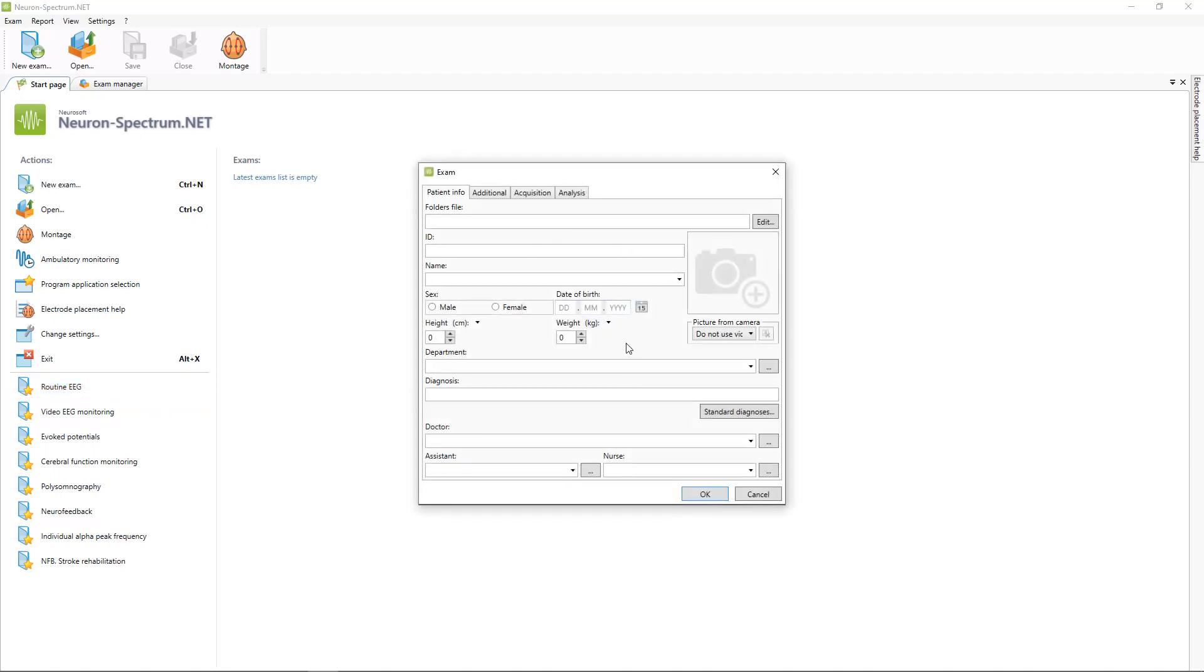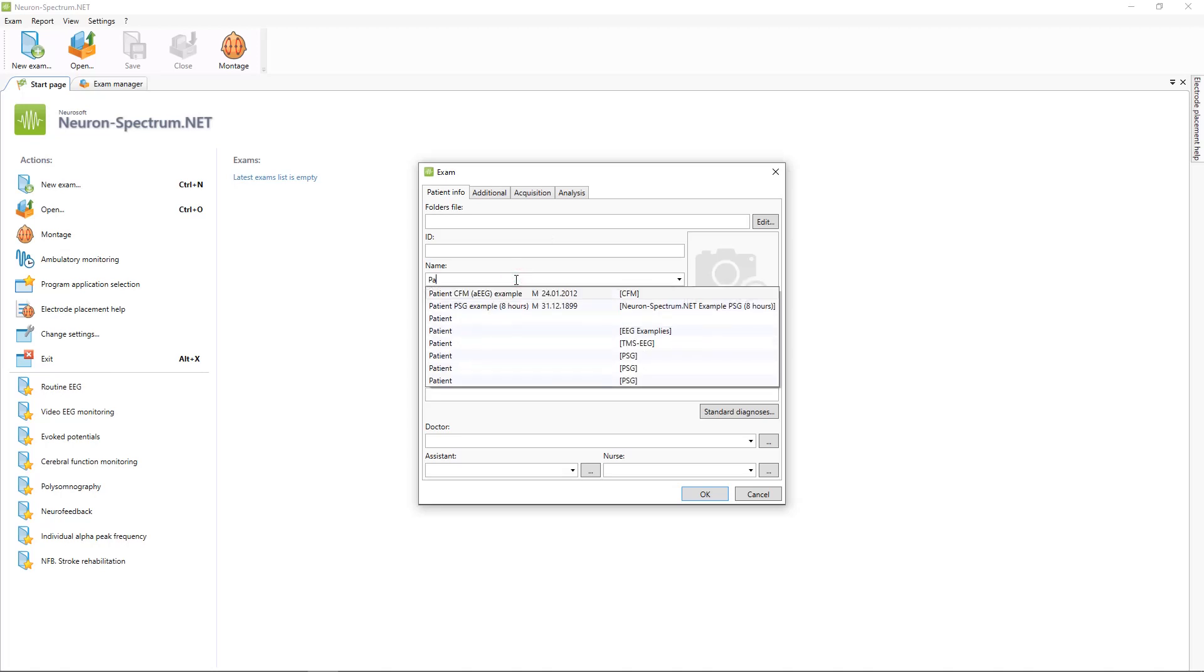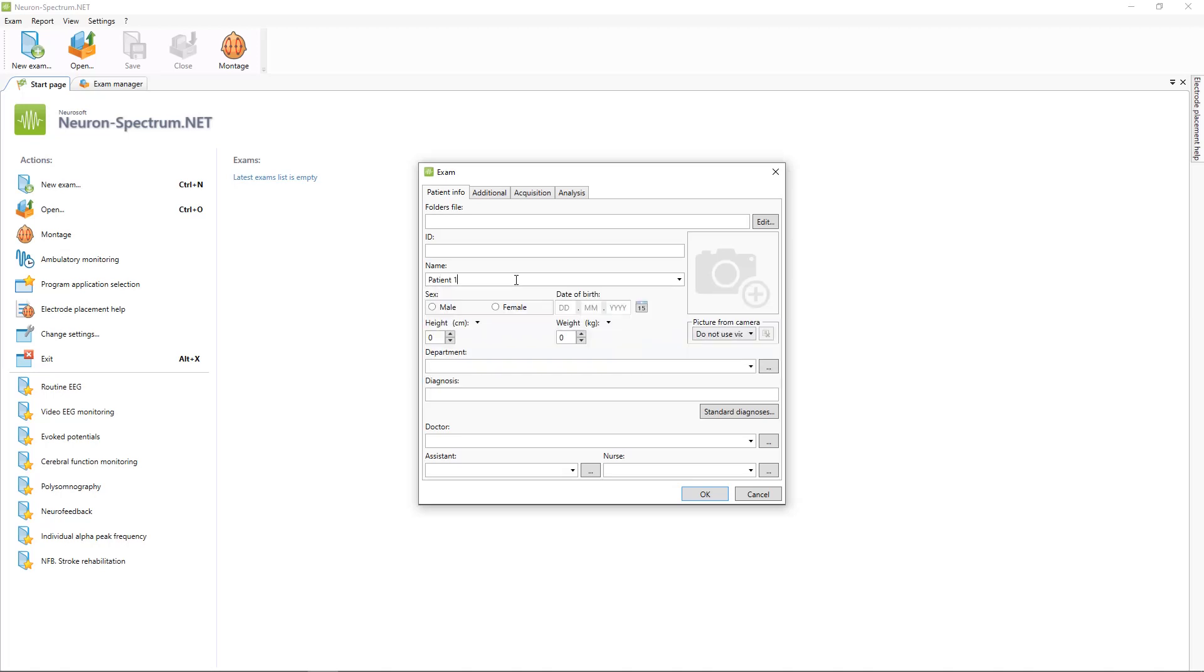On new patient window, you need to put information about your patient. You can add birth date, sex, height, weight, photo and other information.